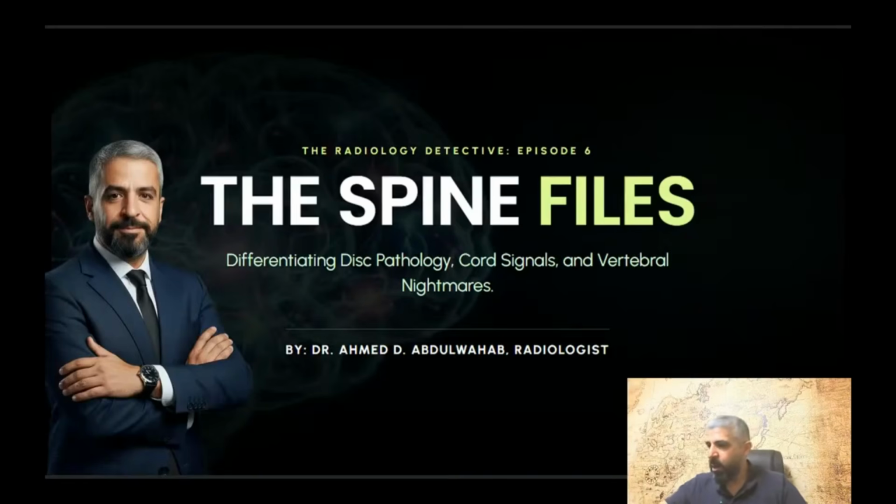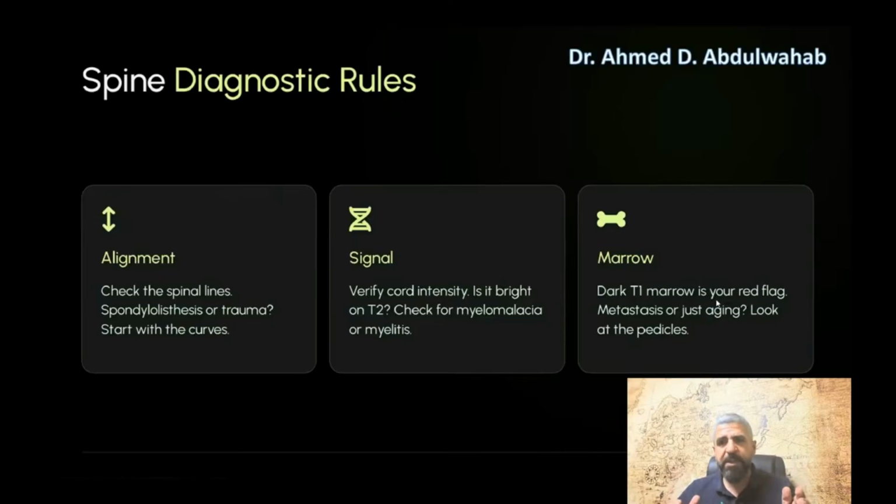So today we will start with our presentation. Today is the 6th episode of the Radiology Detective, and again it's about neuroimaging. And today we will talk about the spine files. First of all, to solve the spine mystery, you need a system. I call it the ASM protocol. A is for alignment, S is for signal, and M is for marrow.